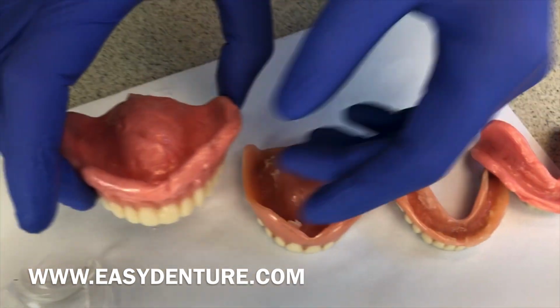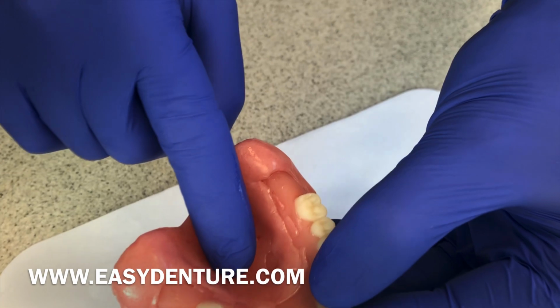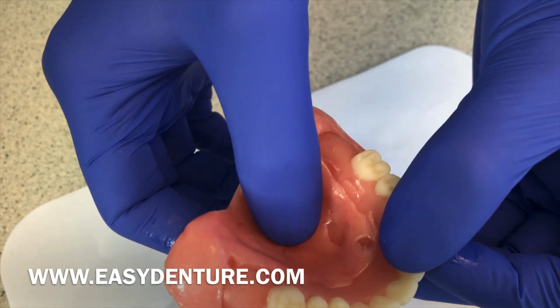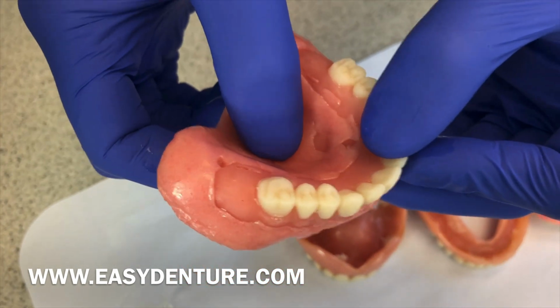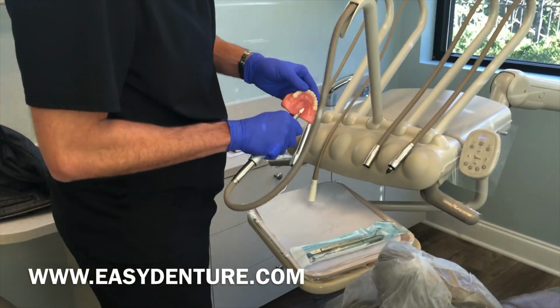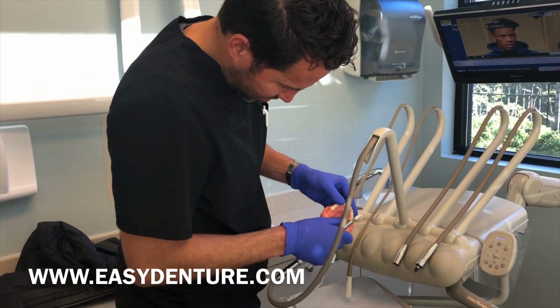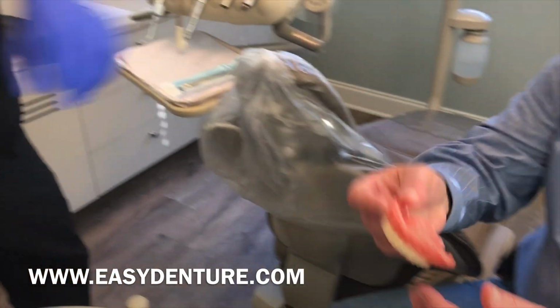You did mention that on the inside here you could feel a little click here, and that's from our internal skeleton there. So what we'll do is I'll take a little acrylic burr and smooth that off. We could also reheat this and push that area back in where it's covered by our NuvaFlex stretch material. But I'll go ahead and use standard acrylic burrs. Go in there, move that spot down. Should be good as new.